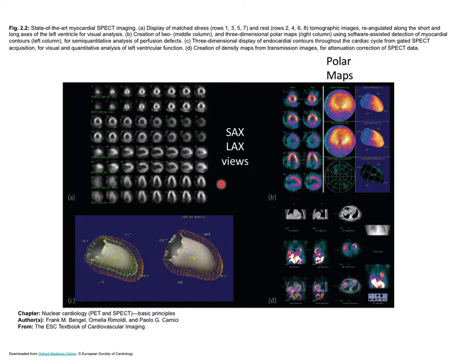The SPECT image itself is a 3-dimensional imaging method, and so these views are sampled from that 3-dimensional volume and stuck up on the screen. Okay. So this is raw intensity after image reconstruction, shown as pixel brightness. You can color the intensity as well, just for human perception, to say that if you get to a certain color transition, your perfusion's at a specific level.